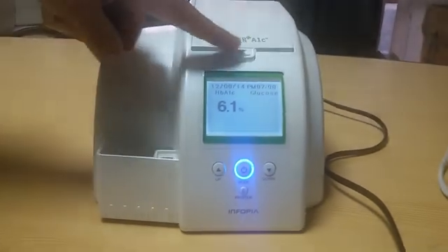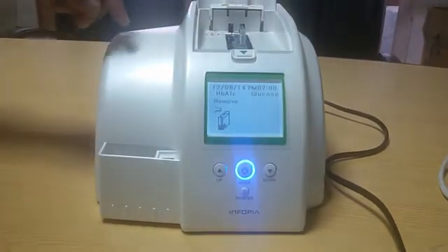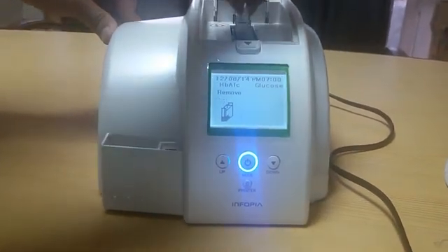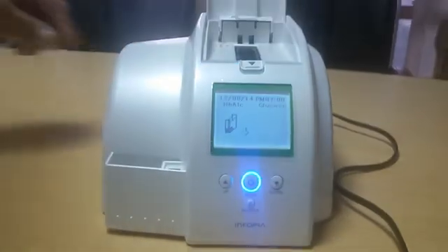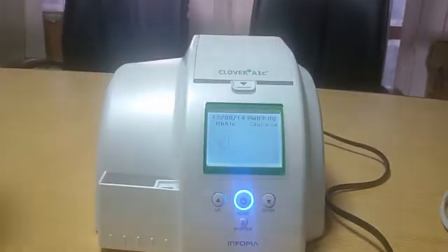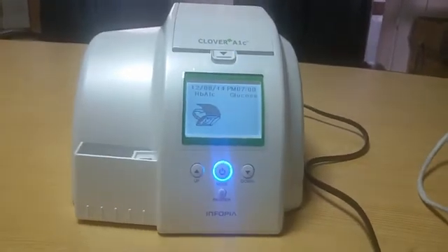Now open the cover and push the cartridge slightly to the left side to easily take it out for disposal. Always keep the cover closed when you are not testing. All the best!